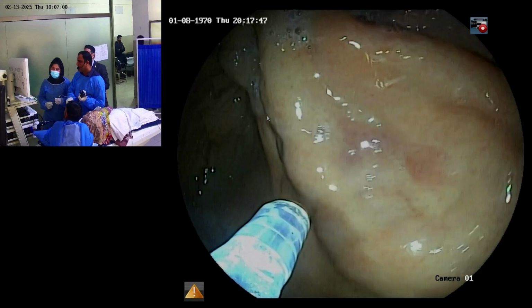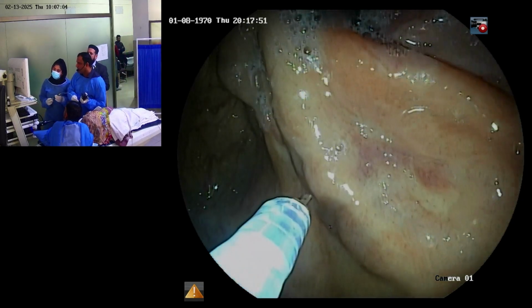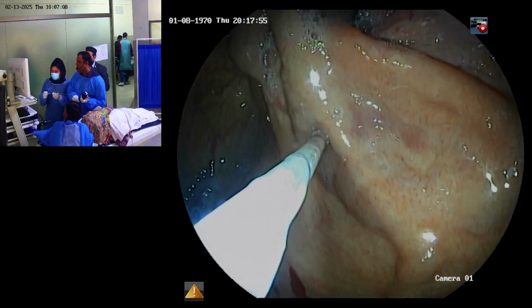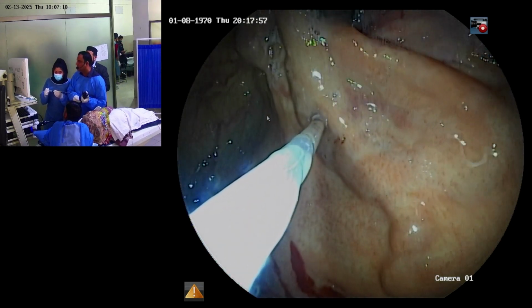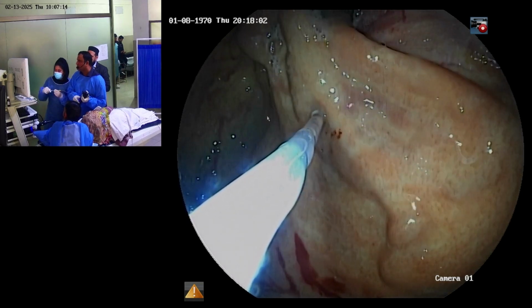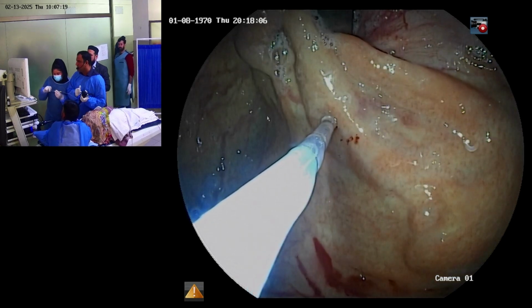Yes, needle out. Yes, inject. Tuck the sheath against the varix and then needle out, or push with distilled water.